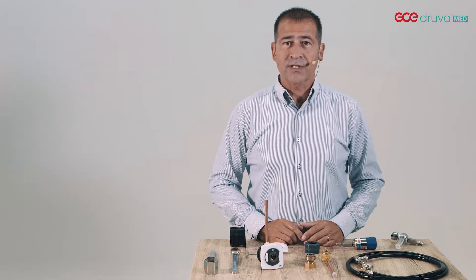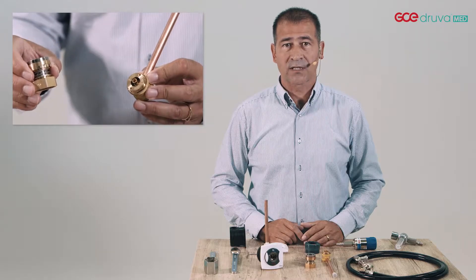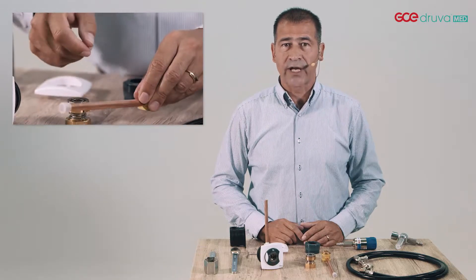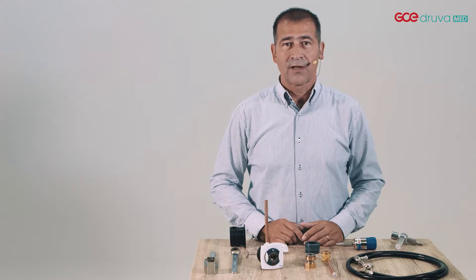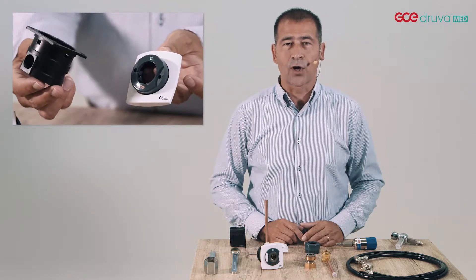GCE MediUnit first and second fix are fully made of brass. There are no plastics used in the gas-specific parts, except the internal washers. Plastic components easily get damaged or break and cause downtime and repair costs. Therefore, GCE chose to equip MediUnit with plastics for the housing and covering only.